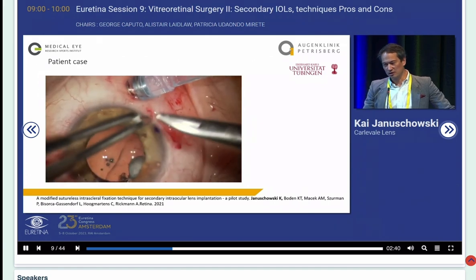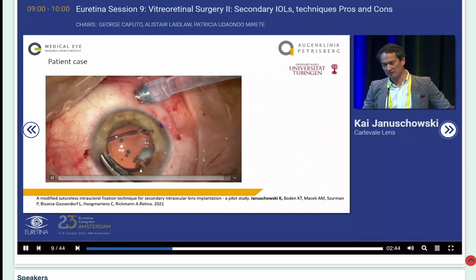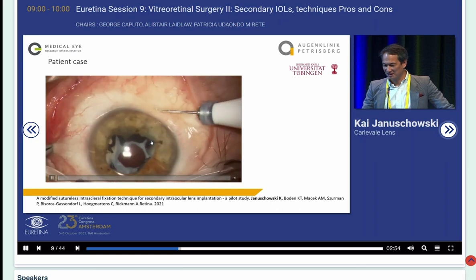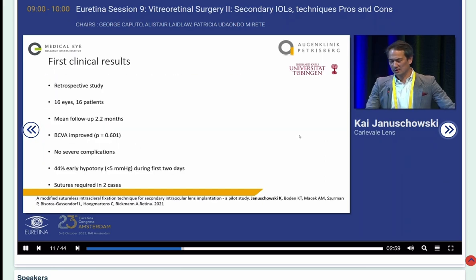Then you suture it, and then it's done. And what you see there as well is that there's this tiny bit left on this video. And I got really lucky to take it out. And after editing this video, I was thinking, gosh, how did I not see that? Ended up okay though.